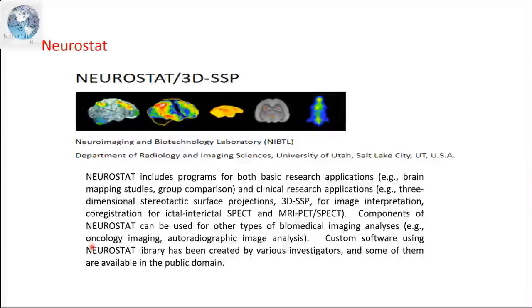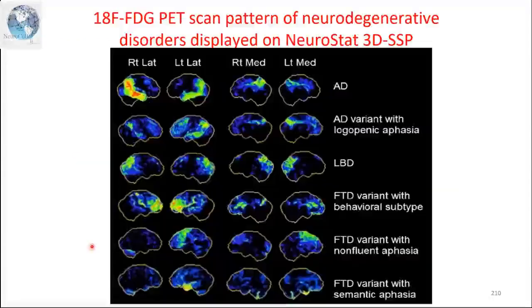Okay. And like I said, ada software kan yang boleh kata adakah dia hyper or hypo. Kita tak payah nak tengok je dan tentukan. Software ni dapat bagi the map. Jadi dia akan bagi values. Okay, jadi kita boleh fokus. Oh, area ni yang bermasalah. Okay, so this is macam Dr. Kamala tunjuk tadi. Dia dah proses. Dia tunjuk je area yang low in metabolism. So dia highlight tempat tu.